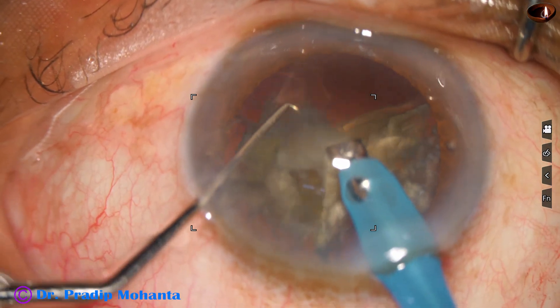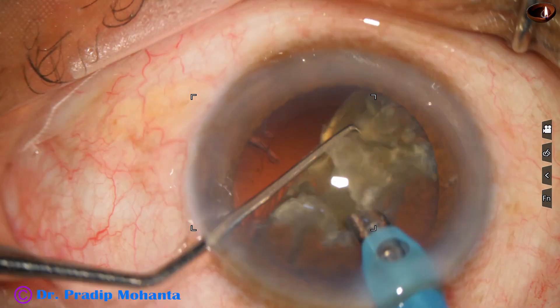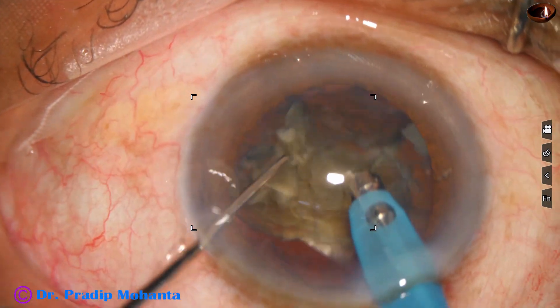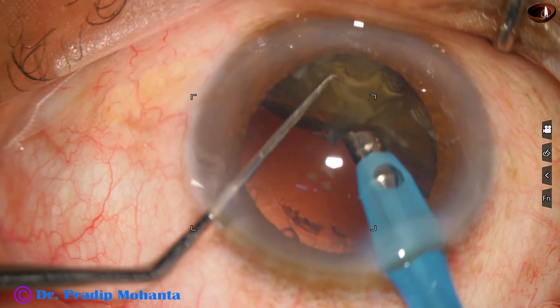The anterior chamber is rock steady — there is no surge. The bottle height is about 110 centimeters. I used ultrasonic energy to make the pieces separate — the other hemi-nucleus is now being addressed.